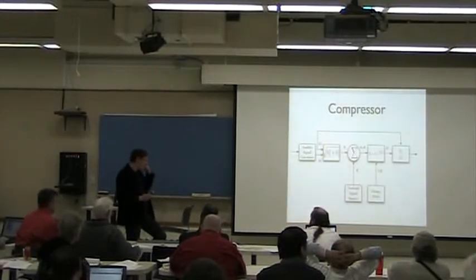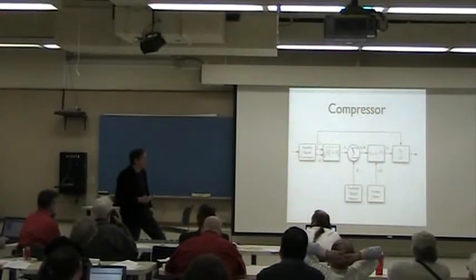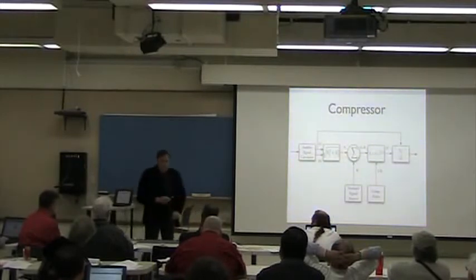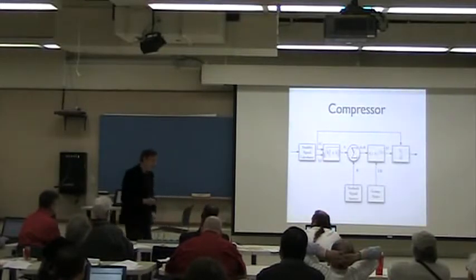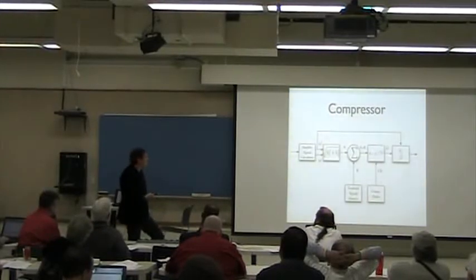And then I got frustrated a little bit about the CORDIC because it was slower than the algorithm based on lookup tables. But then, recently I figured out that it's still good, for example, for this kind of calculation, because we didn't have enough space to place the lookup table to calculate the sines and cosines.